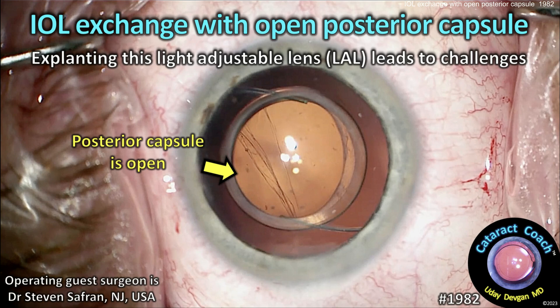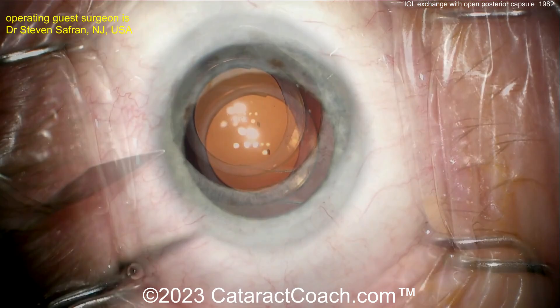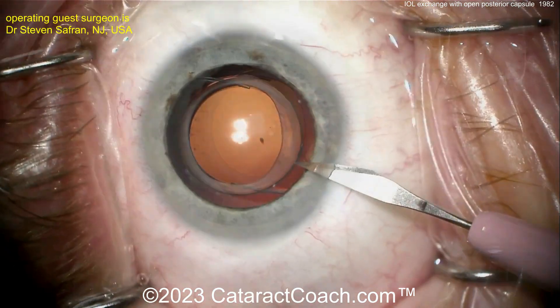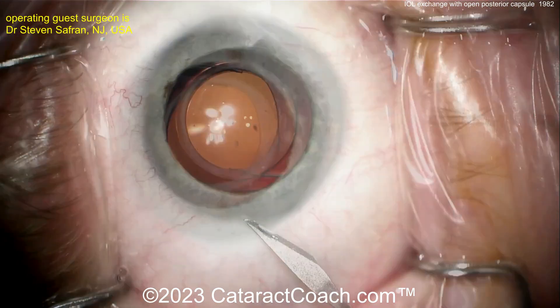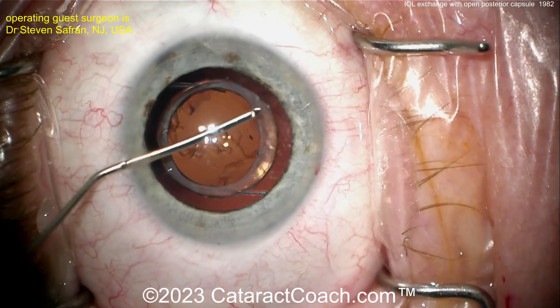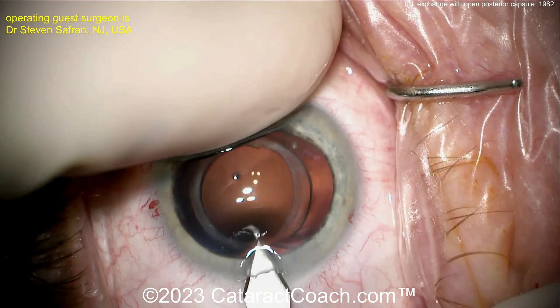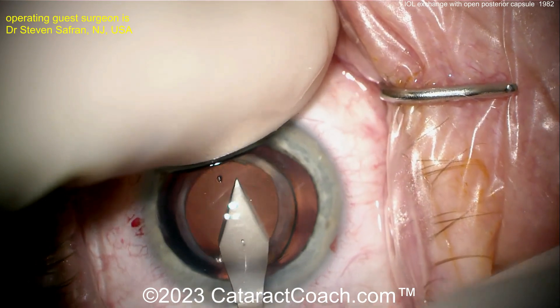From cataractcoach.com: an IOL exchange with an open posterior capsule, explaining the challenges this light adjustable lens presents. Our guest surgeon is Dr. Steven Safran from New Jersey. This patient has a 28-diopter lens fibrosed in place — note the white ring of fibrosis — and the patient has tremendous negative and positive dysphotopsias and is unable to tolerate the lens.